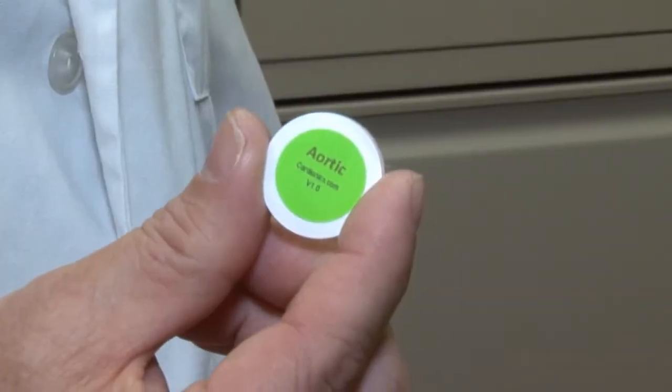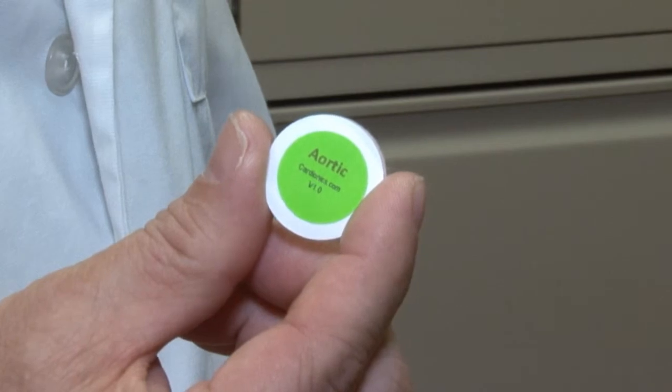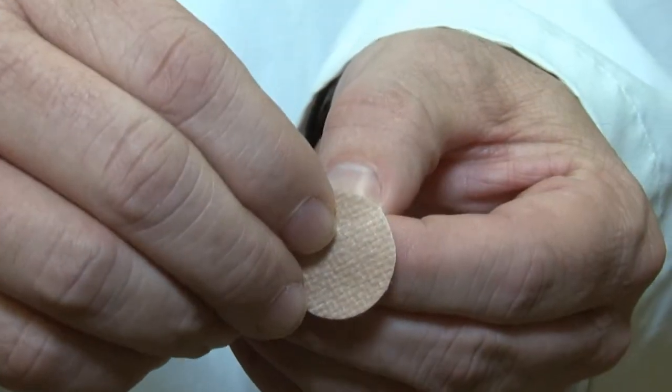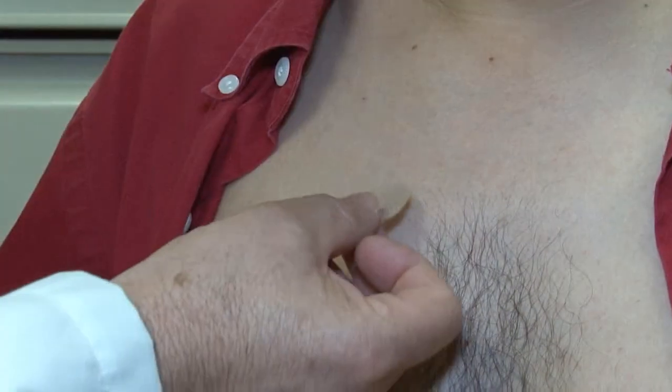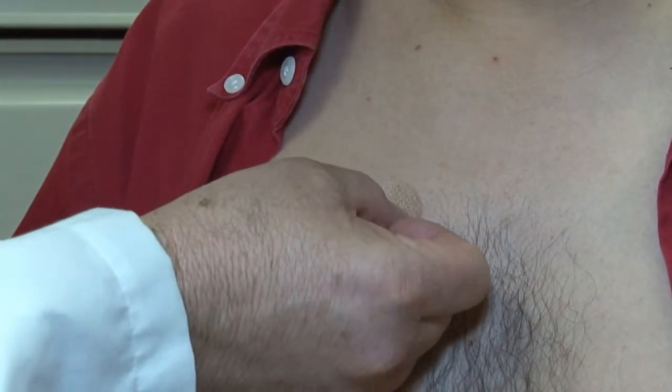Based on the site location written on the back, locate and adhere each patch to the standardized patient.